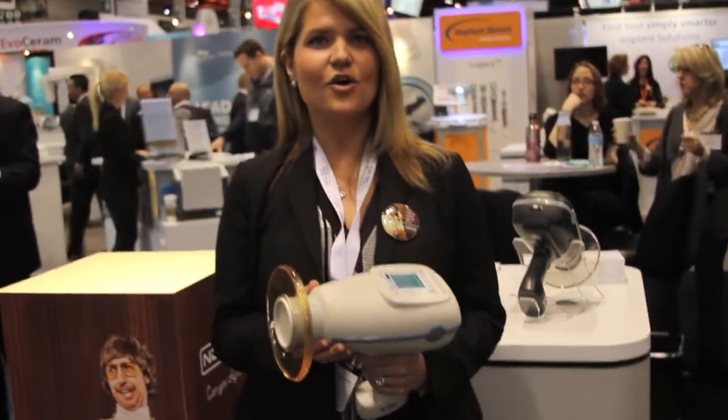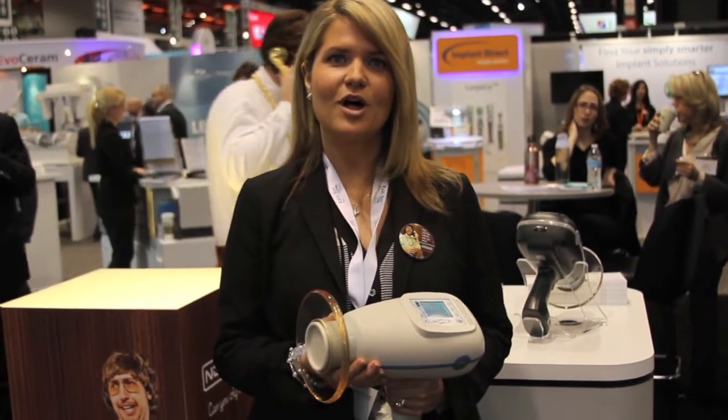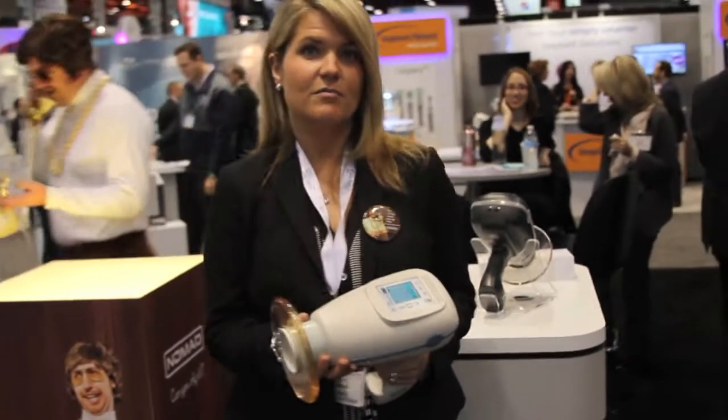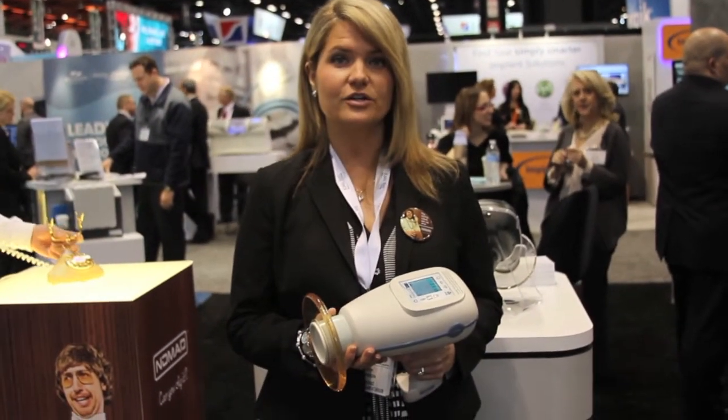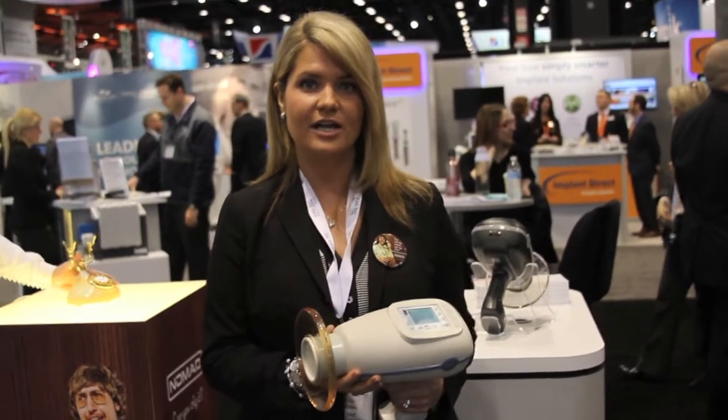This is the Nomad, and he's absolutely right. It's time to take those wall mounts down and get something that's handheld and portable. The Nomad's actually been on the market now for over eight years, and actually one in five dental offices have a Nomad handheld x-ray unit.